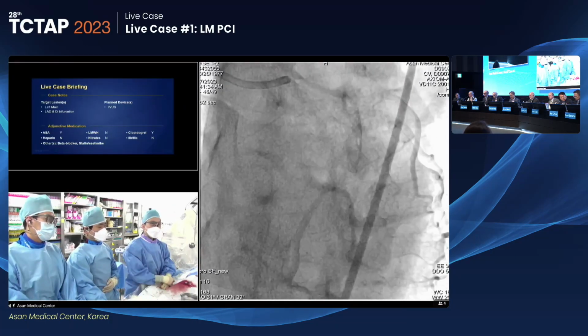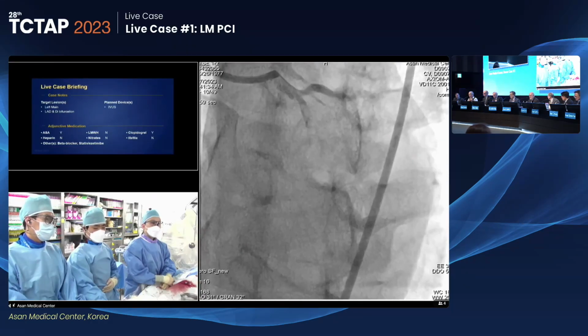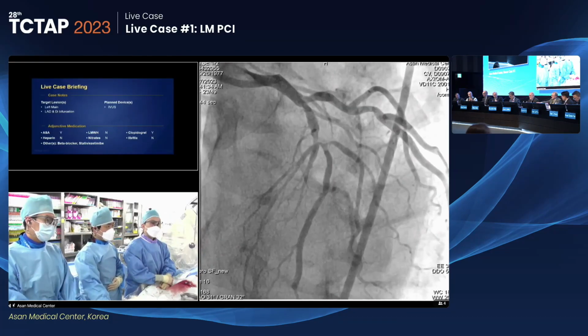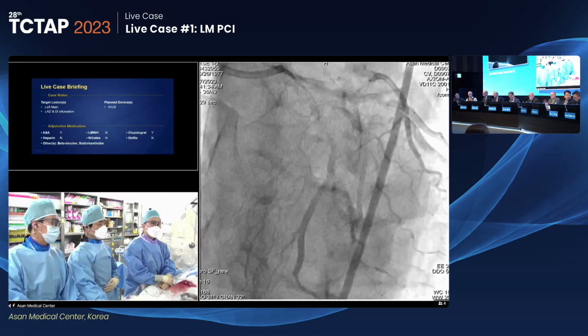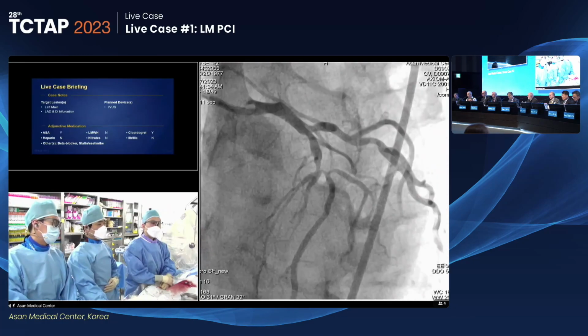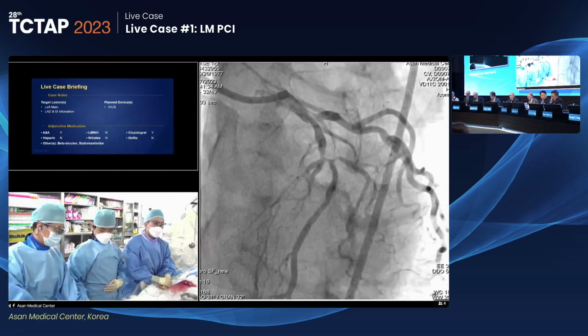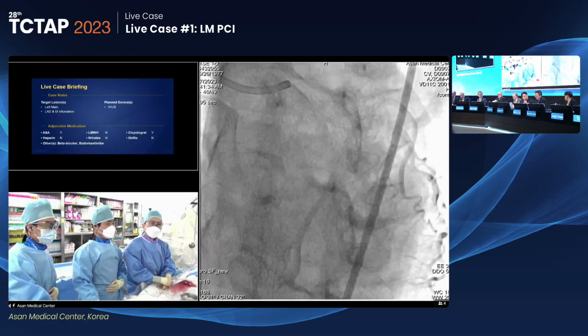And I'm not so sure that there's left main disease. Yeah, I think the ostium of the LAD looks really suspicious here. Of course, the ostium. If you do IVUS, the ostium is going to be, but it's okay. I think the biggest challenge here is actually to wire the diagonal. Yes, I agree. The wiring is going to be tough. So you will need some techniques here to go into the diagonal. Georgie, Dangas, what did you do there?